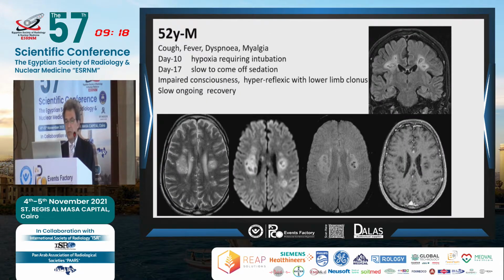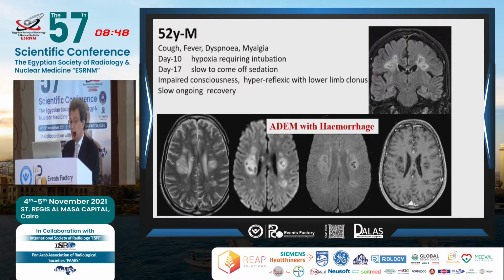Another patient, 52-year-old, had on day 10 hypoxia, so required intubation, and then was coming off quite slowly from the sedation. And the consciousness was impaired, and you see that there are quite extensive, ill-defined lesions in the white matter, some associated with blood, and in this case, not much of a contrast enhancement. So this was an ADEM with hemorrhage. It's one of the manifestations.